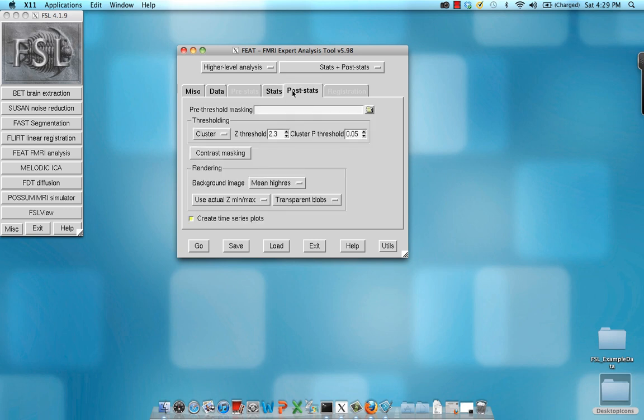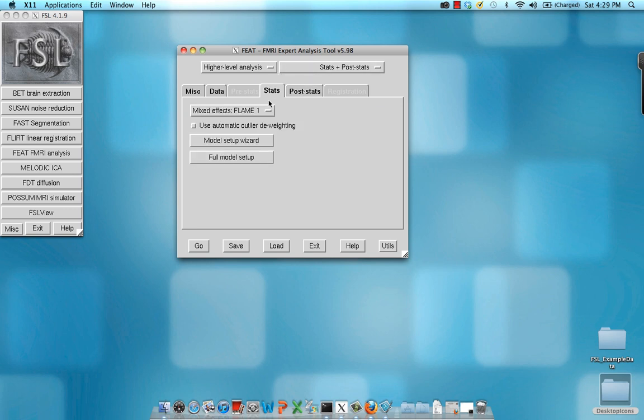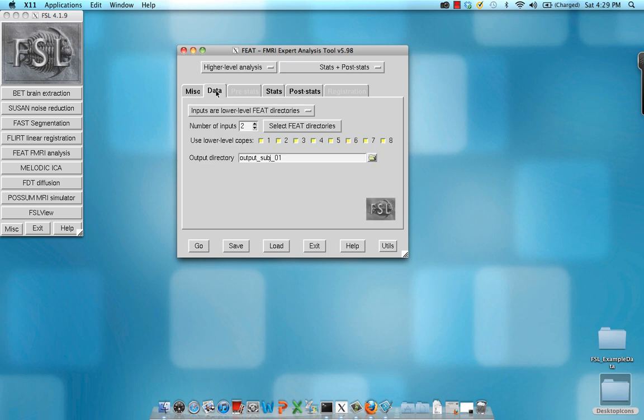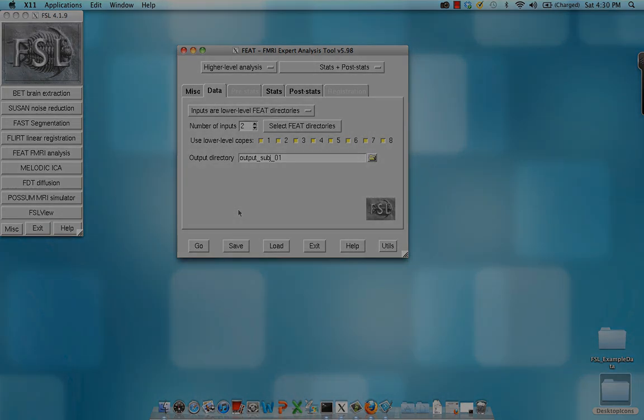And that is pretty much it. And then for post stats, those can be a lot the same, or you can change the z-threshold as you like. After you're done with all this, everything looks good, just hit go, and you will see a similar series of HTML files as you saw when we were running them individually for each run.